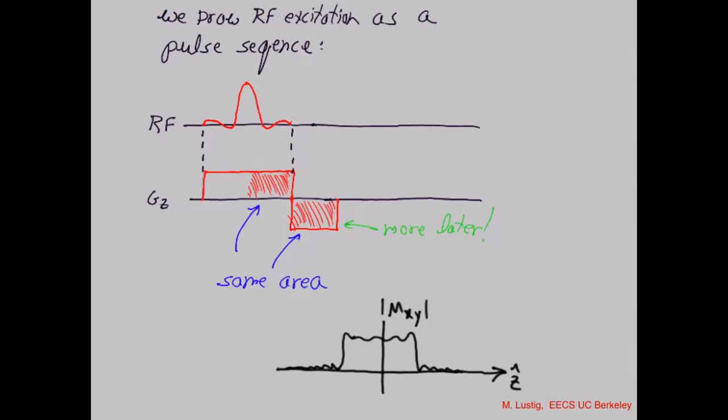The range of frequency through the entire volume is now wider, so across that particular range of frequency, it represents actually a narrower, a smaller part of space. Right? The same volume now covers a larger bandwidth, so the same bandwidth represents a smaller space. So this is a way to control the slice thickness: changing the gradient amplitude. This is how you control the slice thickness.